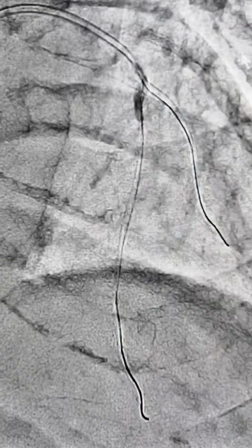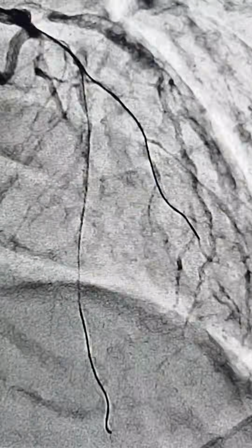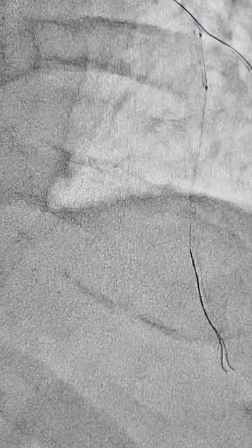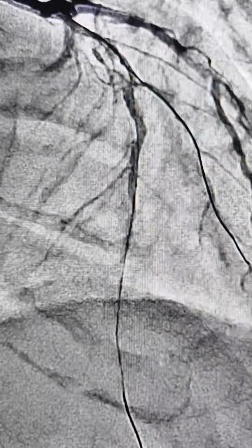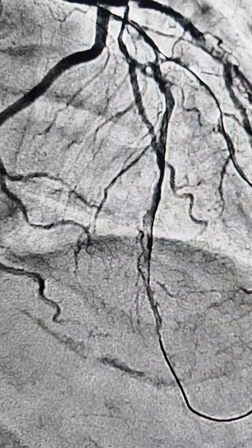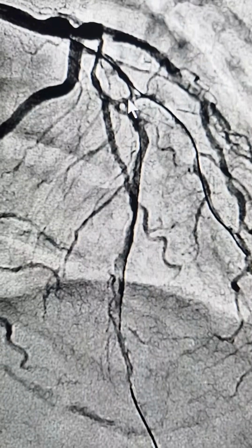And then you can see that this is a calcium nodule. It doesn't open up very easily, so a lot of ballooning, and so we managed to get a balloon down and started ballooning all the way up. So now you can see that the LAD is fairly disrupted. I haven't done anything here, but this is underfilled. The LAD is filling all the way up here.